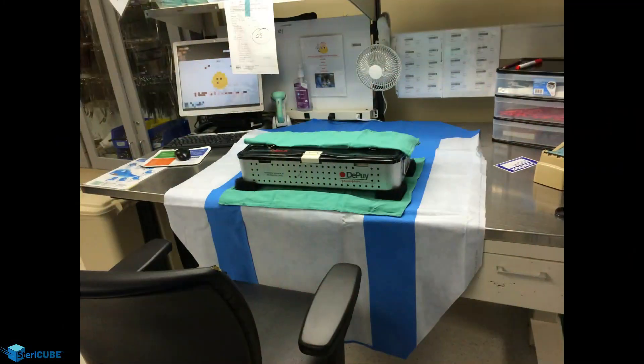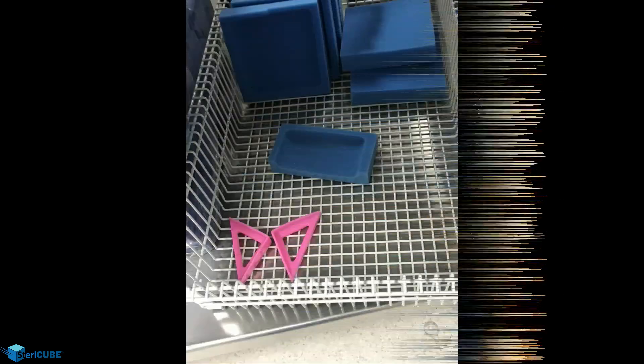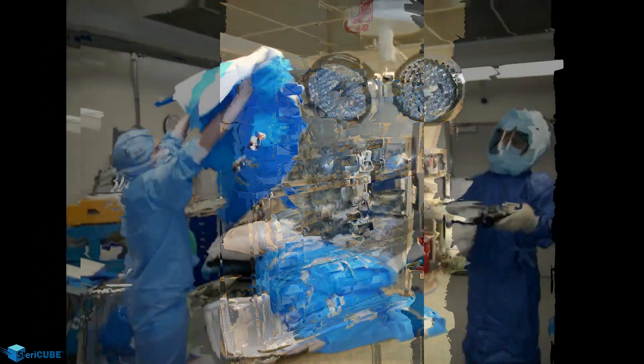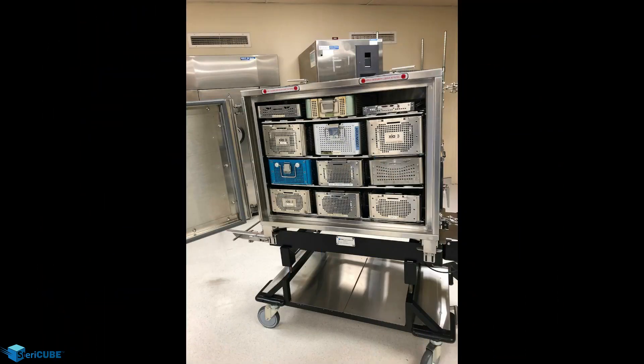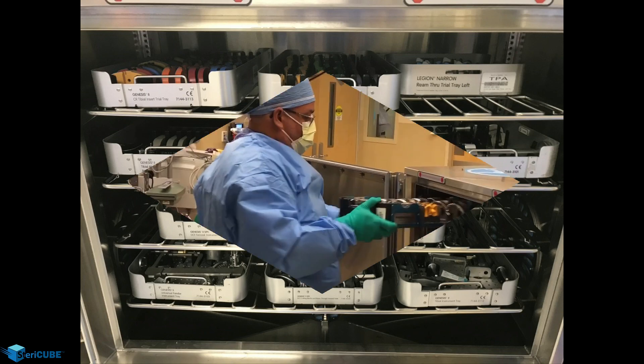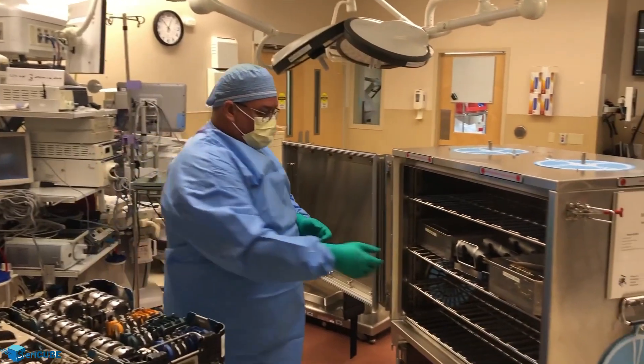Highly manual and variable processes that are prone to defects, such as wrapping, can be eliminated along with associated downstream defects such as compromised wraps and mislabeled trays. The large capacity of the Stericube lends itself to complex cases with several instrument sets and ensures the trays are sterilized and delivered together as a unit. Once the procedure cards are fulfilled prior to sterilization, the instrument sets stay together until the cube is opened in the OR.